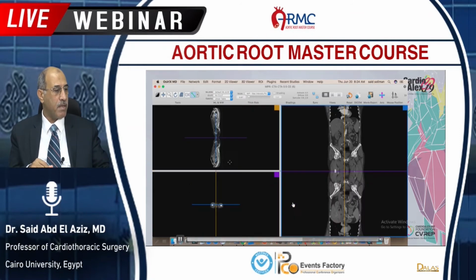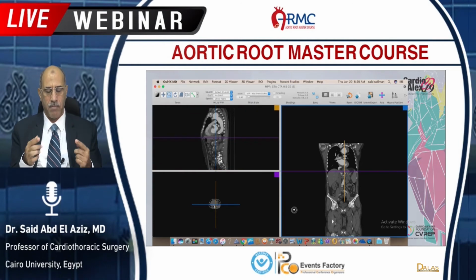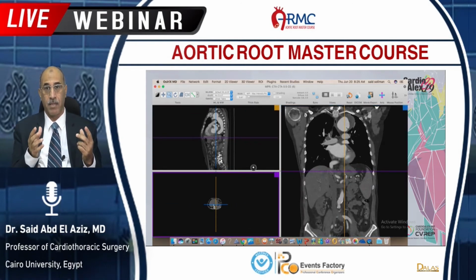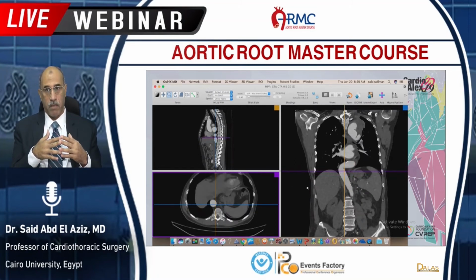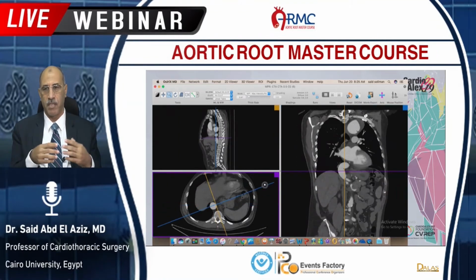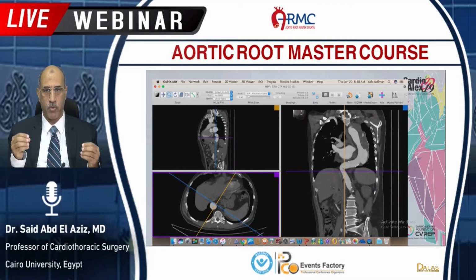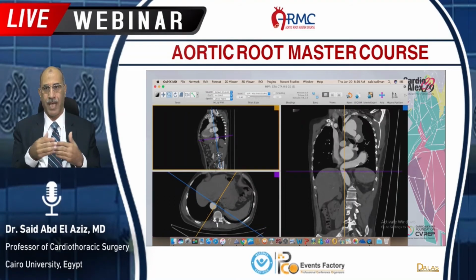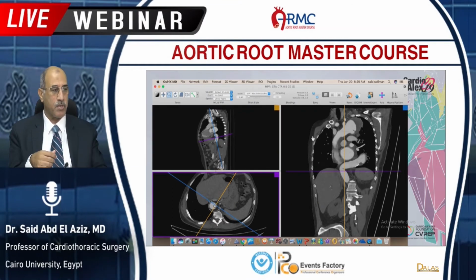Also, another thing that we need to measure is the length. So we will use one stent or two stents, because the maximum length of a stent in the companies is 23 and 25. This is one stent, but if it is not available and we need to cover about 30 centimeters of the descending thoracic aorta, we need to have two stents. We can put two stents inside each other with a good landing zone between them. So we have to measure the length.